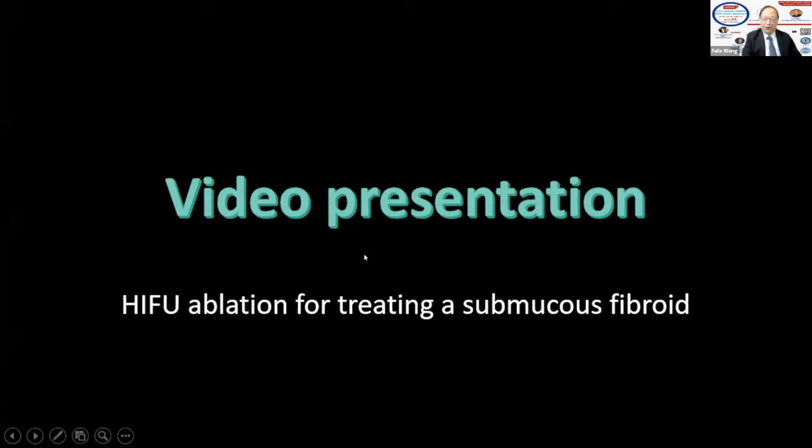First of all, I must say that, due to the time zone difference, I can't do a live surgery. I hope that in the future we can apply this just like when we are doing a laparoscopic surgery.